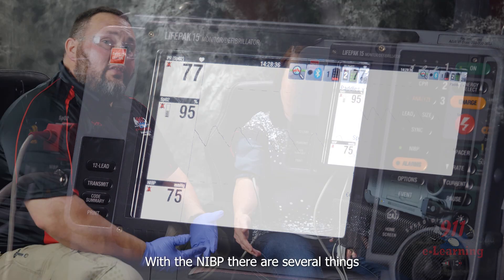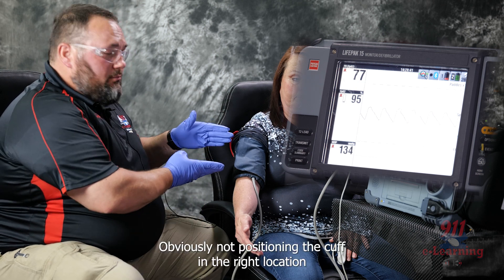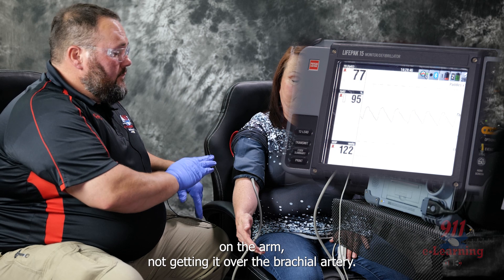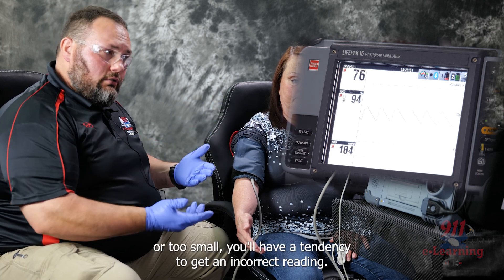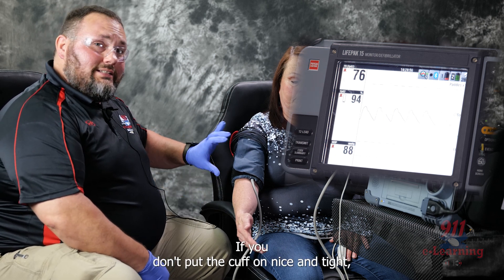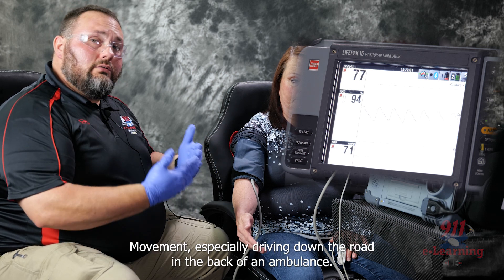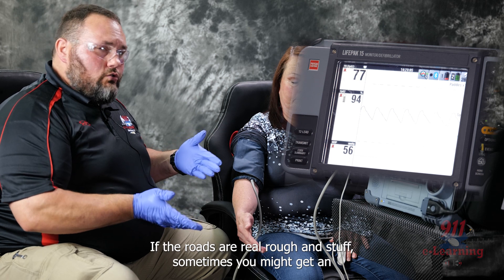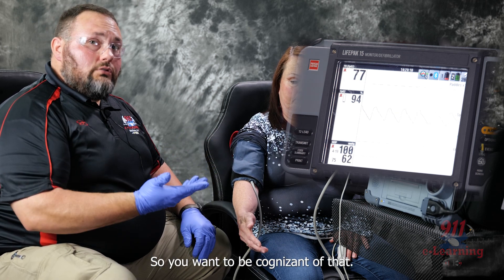With the NIBP, there are several things that can cause an incorrect reading. Obviously, not positioning the cuff in the right location or not getting it over the brachial artery. If you choose a cuff that is too large or too small, you'll tend to get an incorrect reading. If you don't put the cuff on nice and tight, you'll also tend to get an incorrect reading. Movement — especially driving down the road in the back of an ambulance on rough roads — can sometimes cause an incorrect reading.